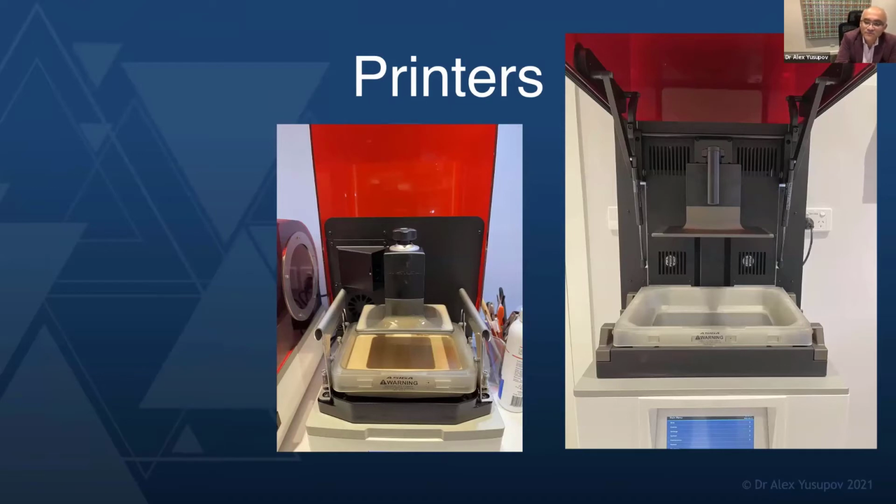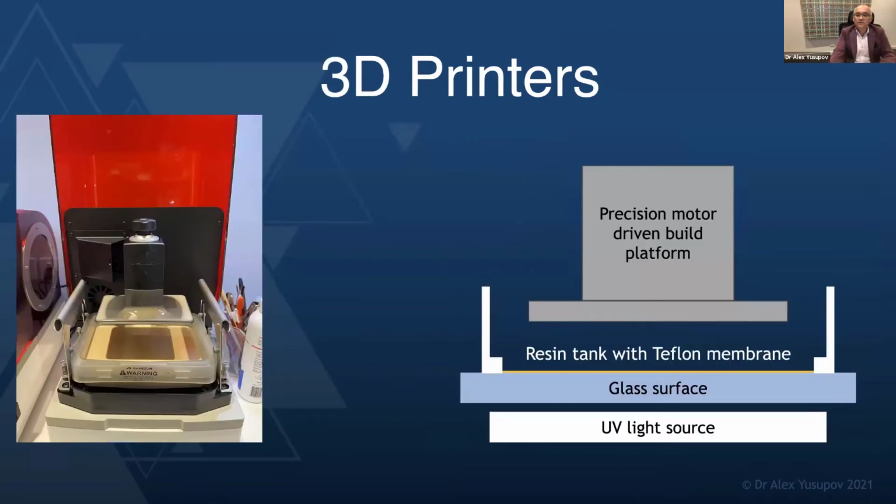They have a moving platform, which is driven by a very precision vertical driven motor. They have a vat that holds the resin, and they have some sort of a light element that cures the resin. So if we look at this, it basically looks like this. You've got the platform, resin tank with a Teflon membrane, glass surface, and a UV light source.